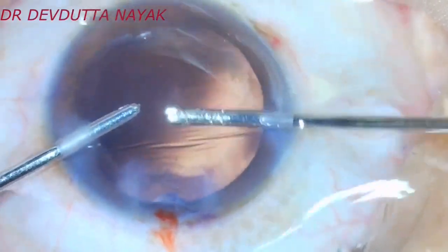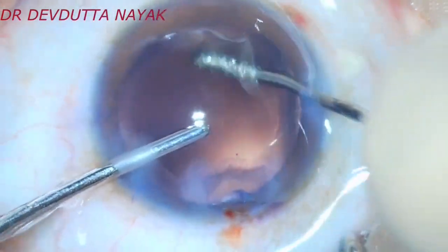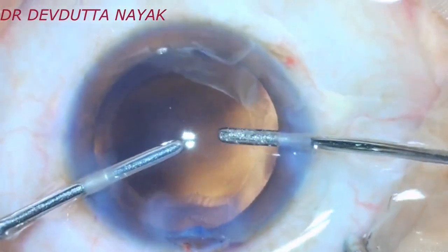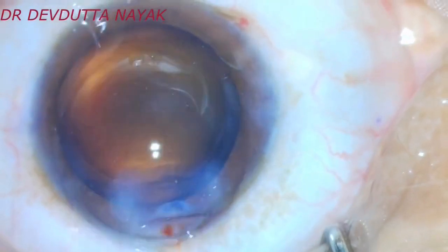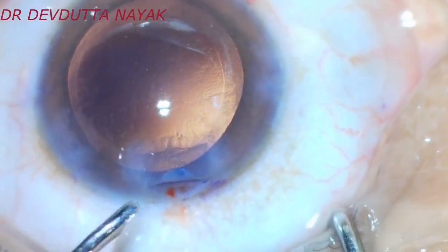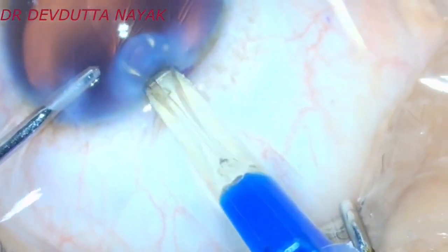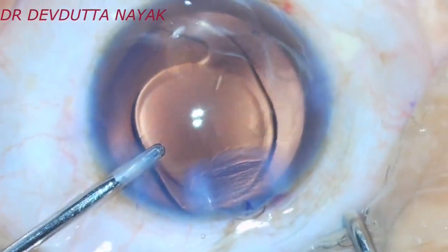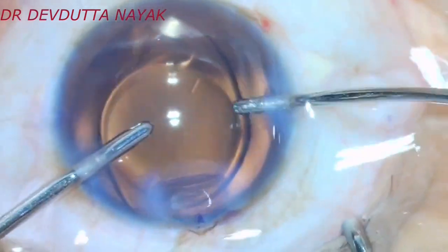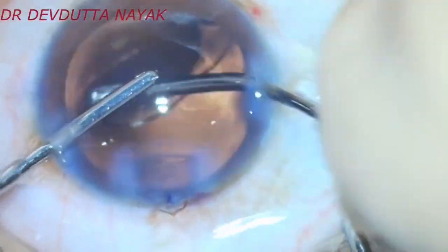A little bit of posterior capsular polishing is being done here. So this is a single piece hydrophobic acrylic toric IOL. I prefer to implant the toric lenses under hydro only, because I don't have to bother for visco removal after the lens implant. And if there is any visco remnant in cases of toric IOL, then there is a chance of post-operative rotation of the toric lens.